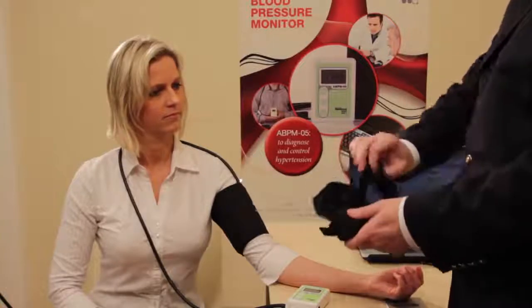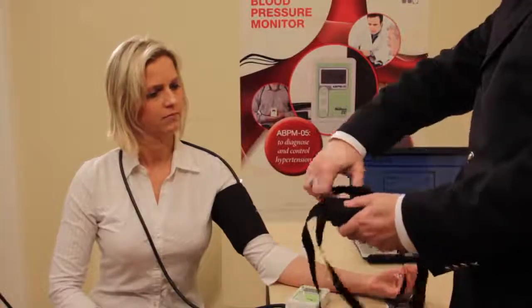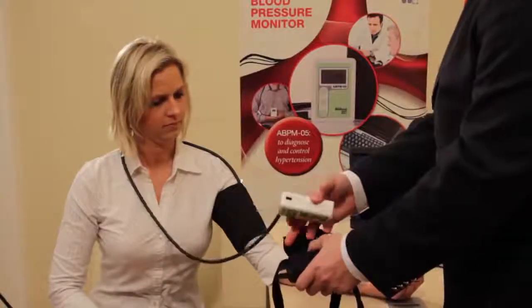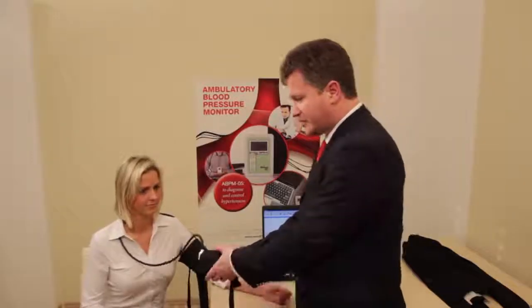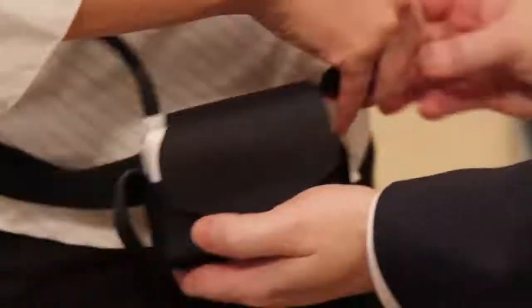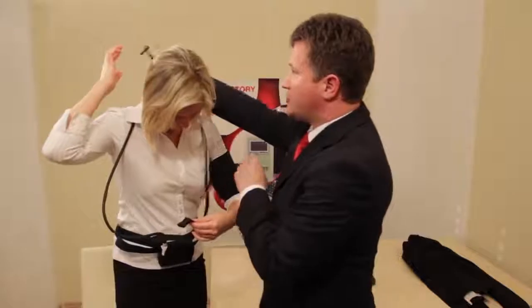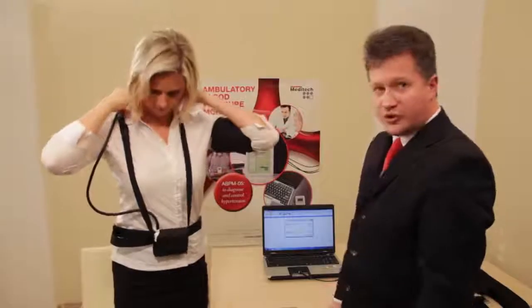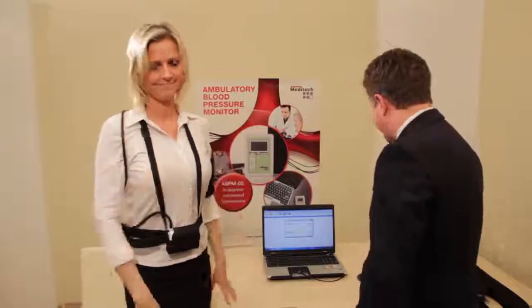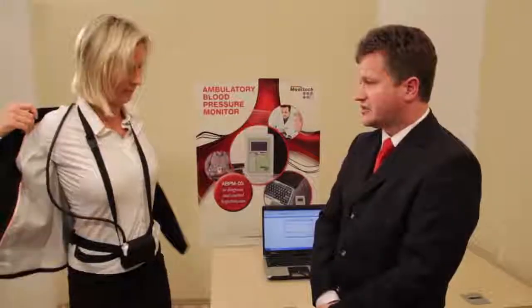This is the pouch. We open it, remove the waist and the shoulder straps. We just take the device, insert it in the pouch, like this. So once the device is securely in the pouch, we stand up. The pouch should be applied around the waist using the waist strap, and if necessary, it can be secured around the neck using the shoulder strap. And so the patient is ready to go for the 24-hour blood pressure monitoring session. A loose-fitting jacket could be used to make the monitoring less conspicuous.